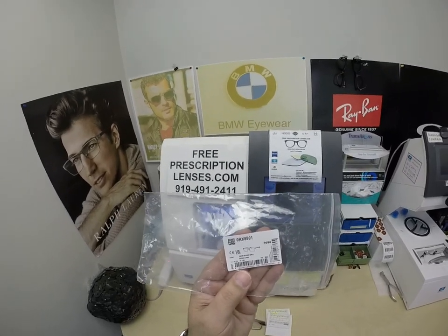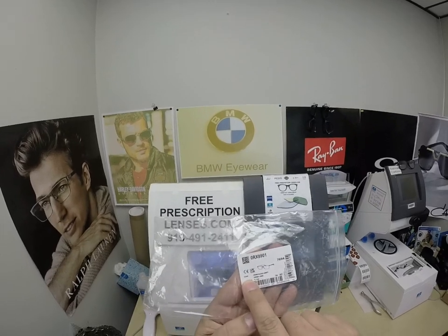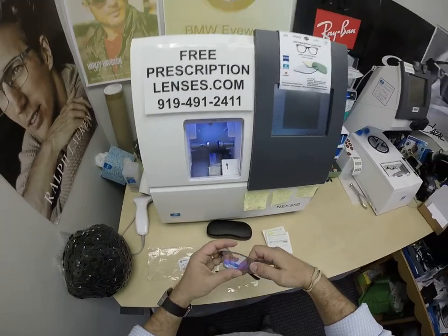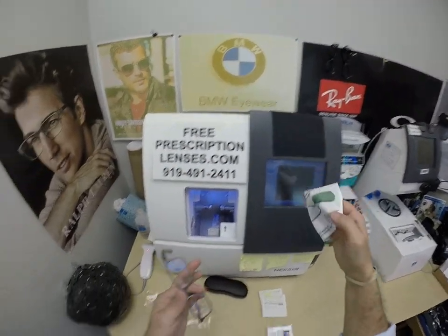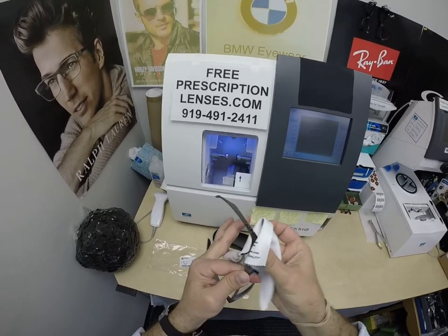When I show you Aaron's Ray-Ban 8901 — now this frame comes in two sizes, 53 and 55. He got it in size 53, color 5244, the Demi Gloss Gray. It sells for $244 and comes with one free pair of clear single vision prescription lenses or non-prescription fashion lenses if anyone wants them.